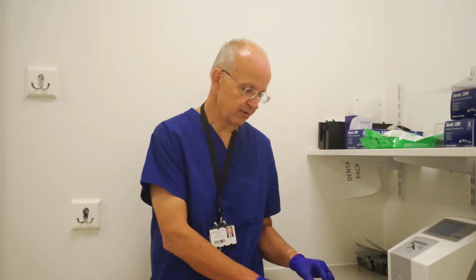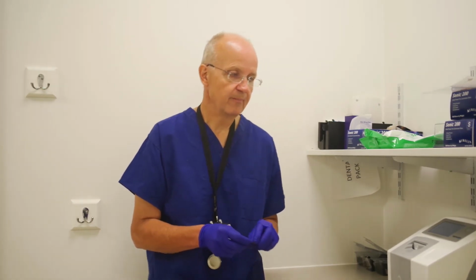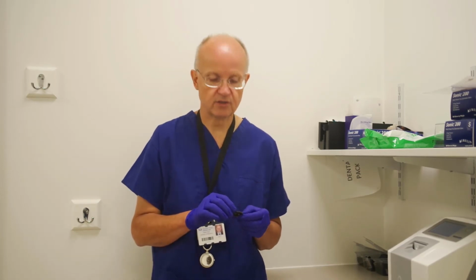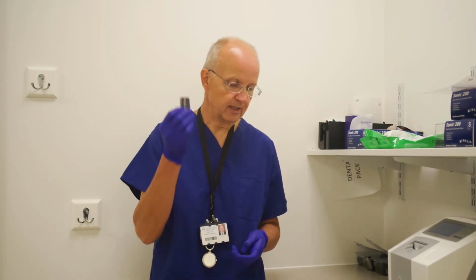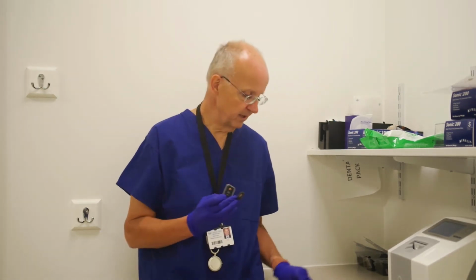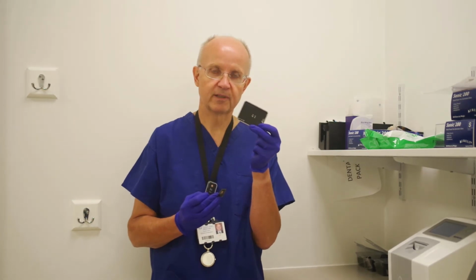Okay, one more thing before we move to actually showing you how to take the periapicals and the bite wings. We need to think about the recording mechanism that we're going to use to actually record the image. We're going to be using these phosphoplates. Remember we talked about these in the lectures at the beginning of term. So this is a size 2 phosphoplate, this is a size 0 phosphoplate, and this is a size 4 phosphoplate.